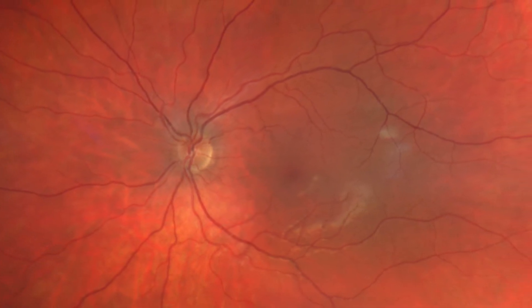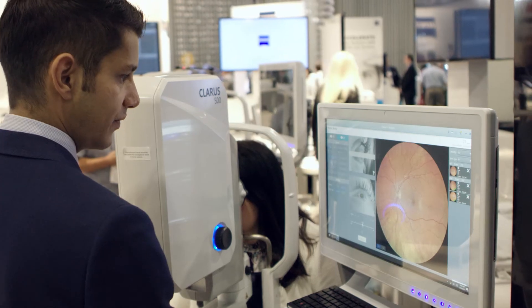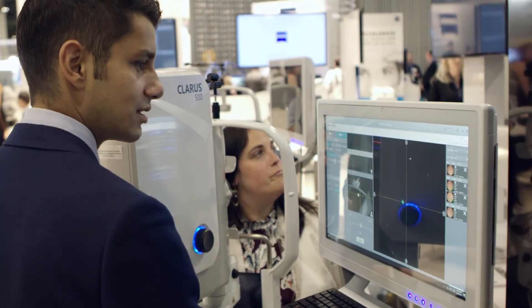The camera has the ability to do a wide field image, which is a single photograph of 133 degrees. It also has an ultra wide field mode, which is two separate images that are montage stitched together. It has fundus autofluorescence acquisition — to do one photograph of both eyes is probably less than two minutes. To do the wide field portion where you take two images, you can still get it done in two or three minutes and get a good quality image.